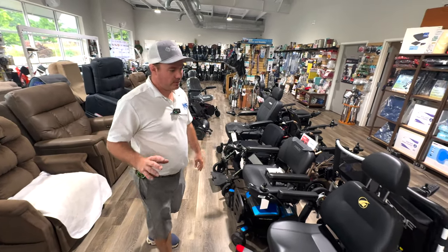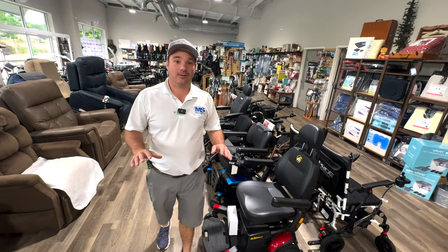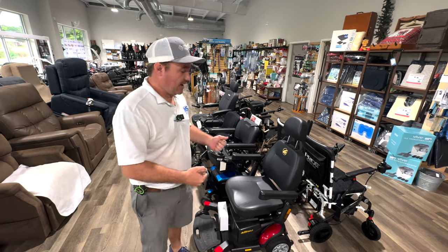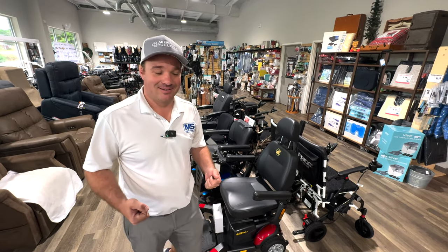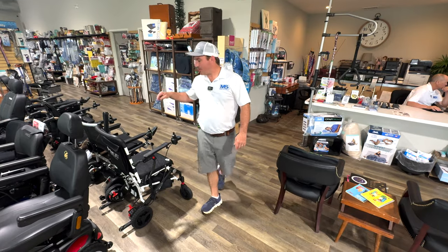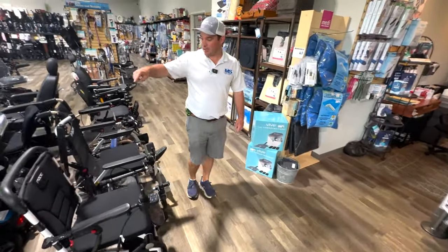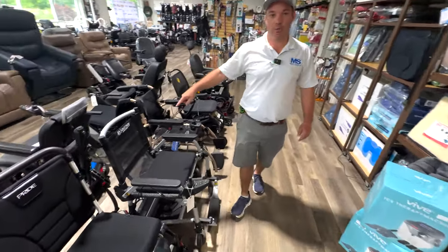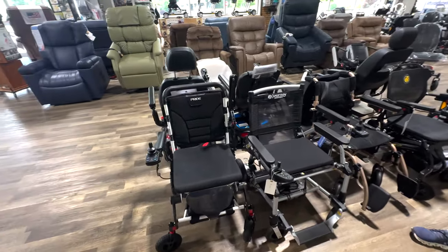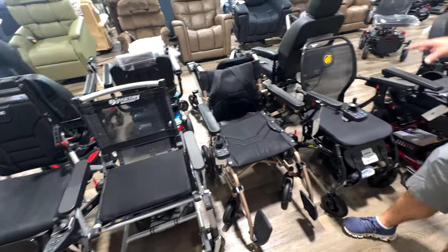Now you might say you don't want to do all that taking apart. I get it — but when I was doing this at one time, the heaviest part was 65 pounds. If you want something you can throw in your car, go to the grocery store, and you're usually on hard flat surfaces, you're probably going to want to check out the Pride Carbon, the Journey Zoomer, or the Golden Cricket. We brought the Golden Cricket in to try it.